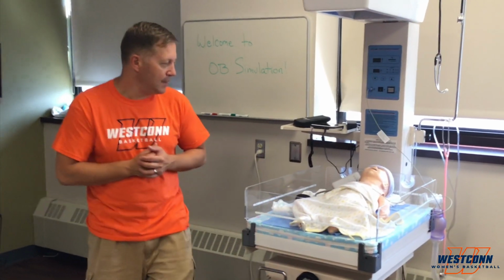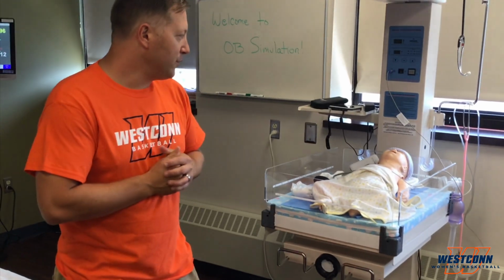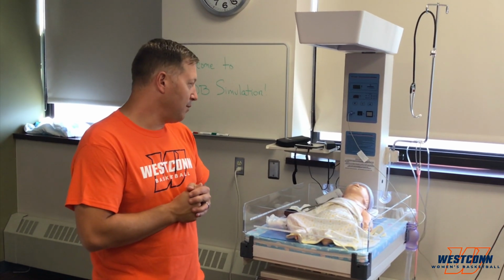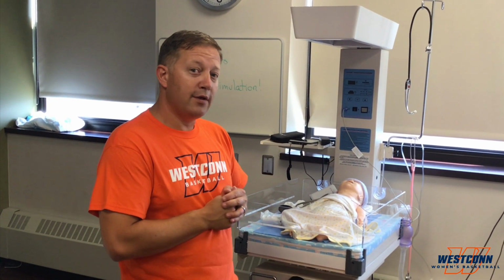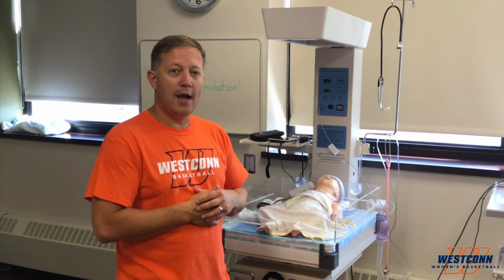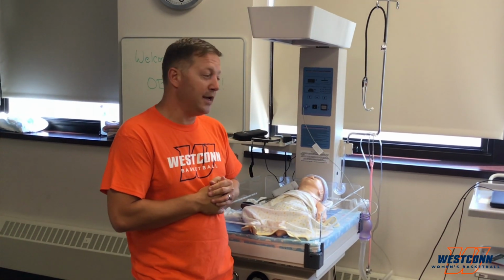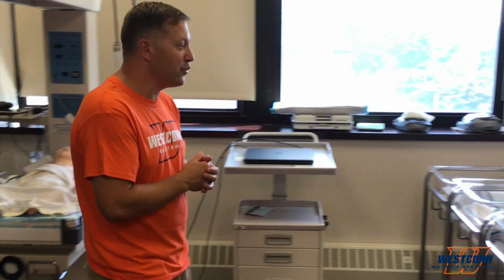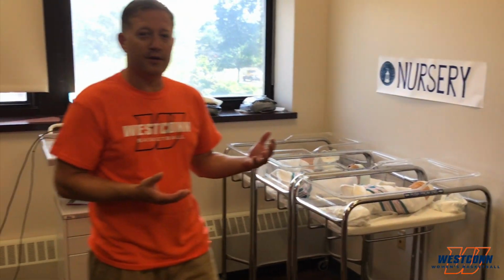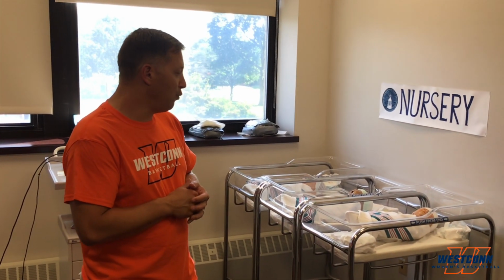We also have a simulation baby over here. This is simulation baby. This mannequin does everything that a baby could do. So this baby has heart sounds, lung sounds, breath sounds. We can make the baby either be a very perfectly healthy baby, or we can have the baby have some complications. So the nursing students really learn how to take care of a newborn who could potentially have some complications. And over here is our little nursery where the students learn how to take the baby from mom immediately after delivery and do the things that are necessary from a nursing perspective with a newborn.